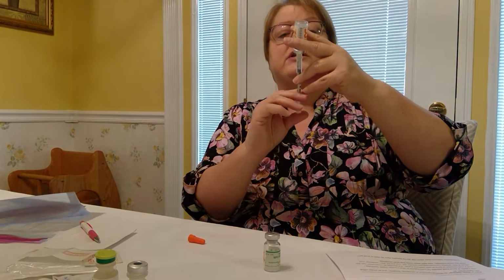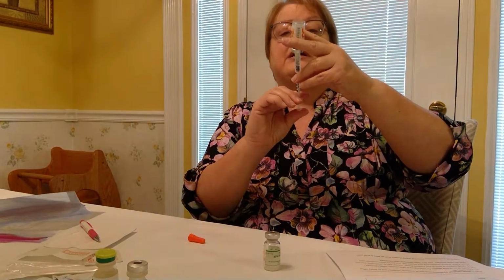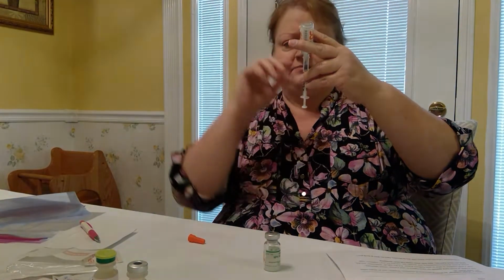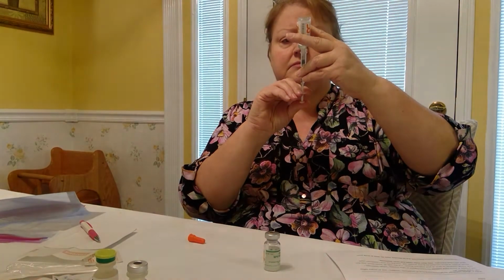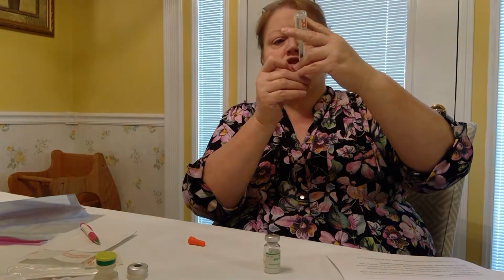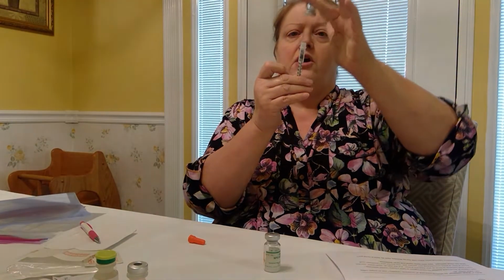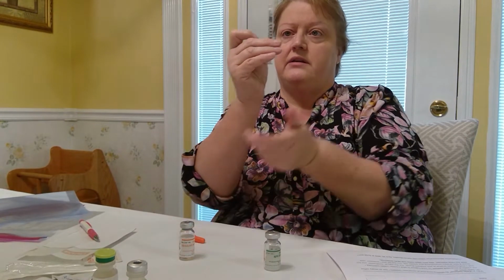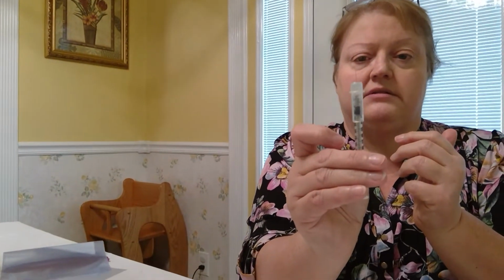If you see that you get too much, push back until you get exactly the amount that you need. Once you have ensured that you have the correct amount and no air bubble is visible, remove it, ensure that your needle is straight and that you didn't bend it, and show it to us that you have the correct amount.